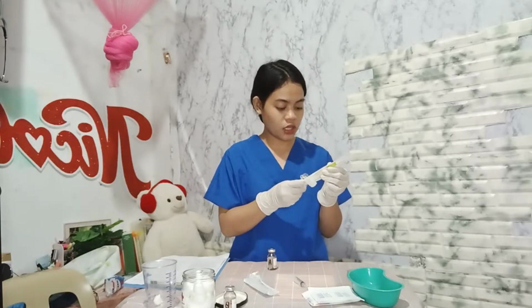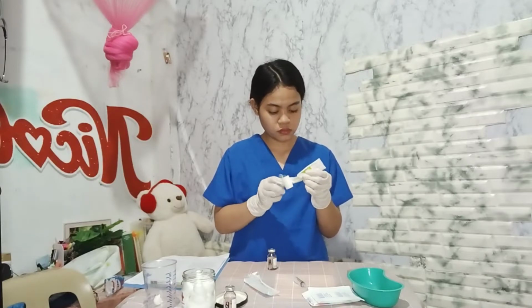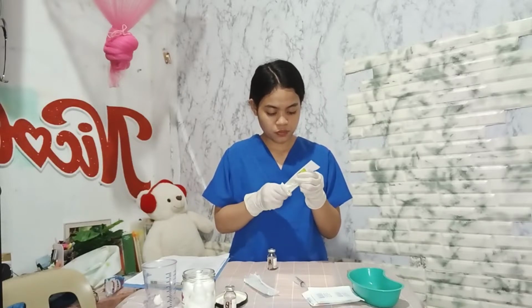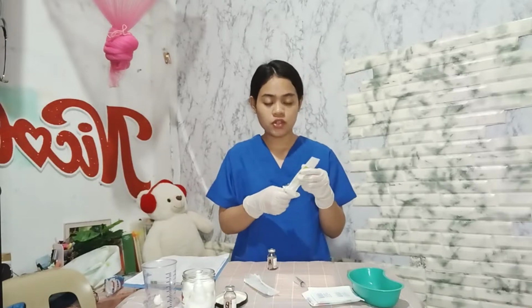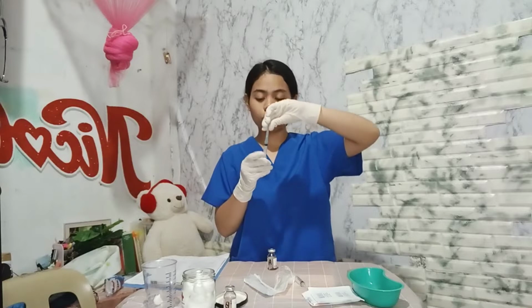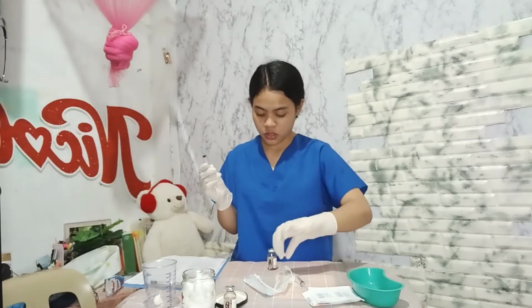Attach the filter needle. Ensure that the needle is firmly attached to the syringe. Remove the cap of the needle, then draw up into the syringe an amount of air equal to the volume of the medication to be withdrawn.